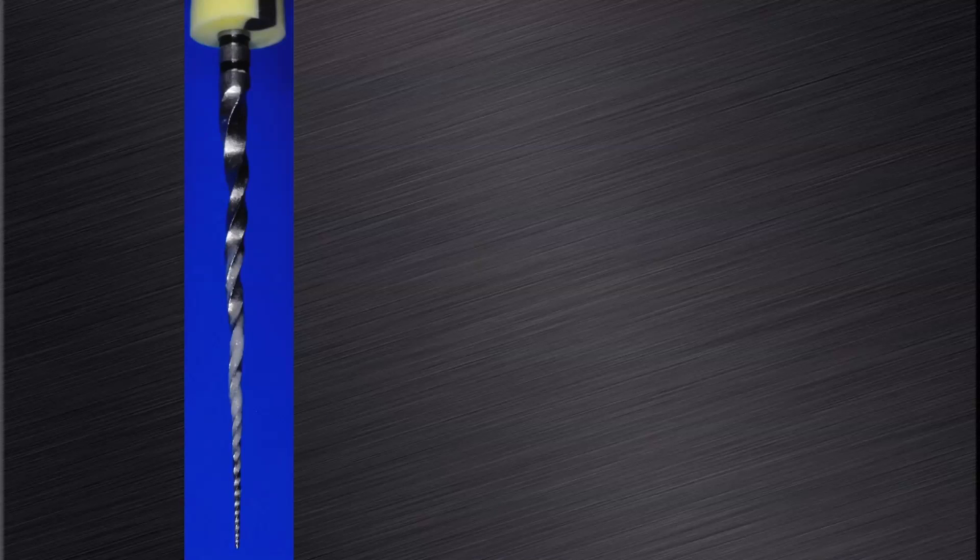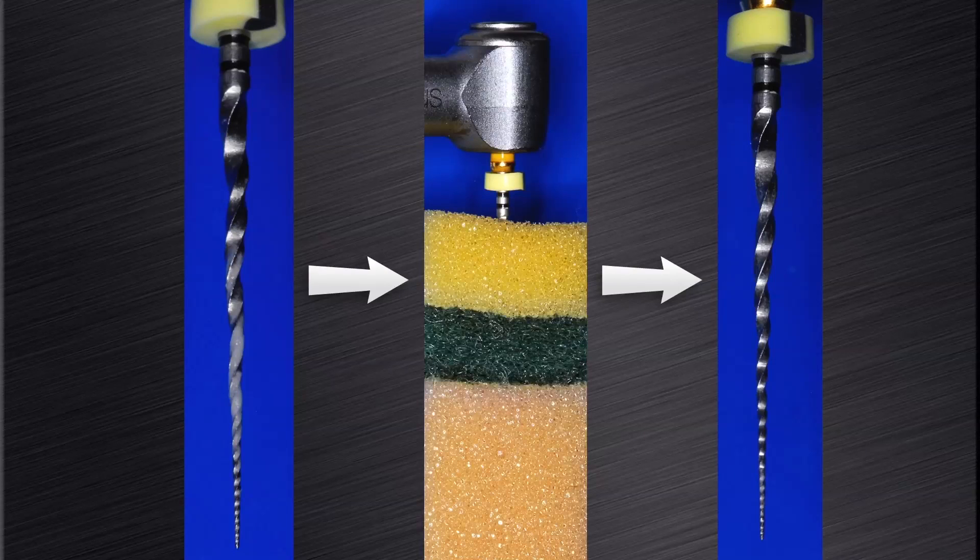Before proceeding, it is important to clean the cutting flutes of the instrument. Here you can see the typical loading pattern of debris on the flutes when the file was used in a wet canal. A sponge is used to remove the cutting debris from the flutes. On the right-hand side you can see that all debris has been removed and the file is ready to be reinserted into the root canal for the next cutting cycle.